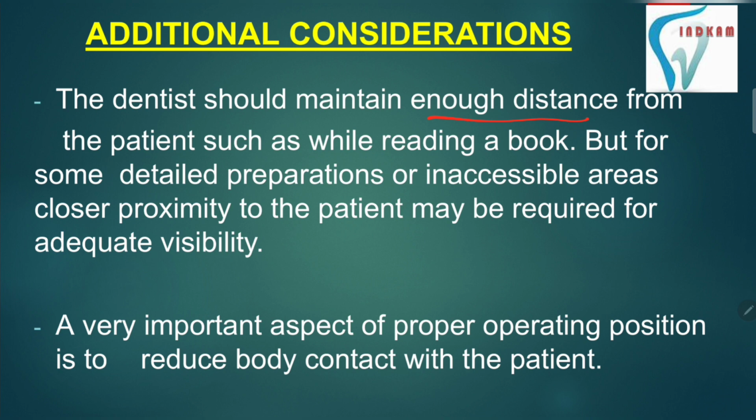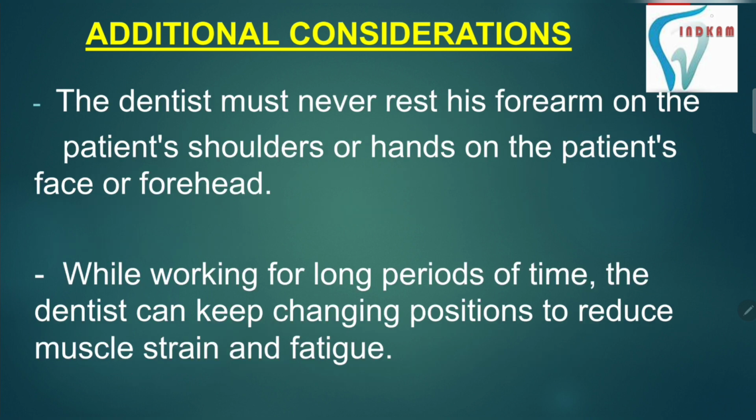A very important aspect of proper operating position is to reduce the body contact with the patient, because no one likes it. Sometimes the patient must be of opposite gender. That time it will be very uncomfortable for the patient also, and it will be uncomfortable for you also. The dentist must never rest his forearm on the patient's shoulder or hands on the patient's face or forehead. It is a golden rule. You should never do this.